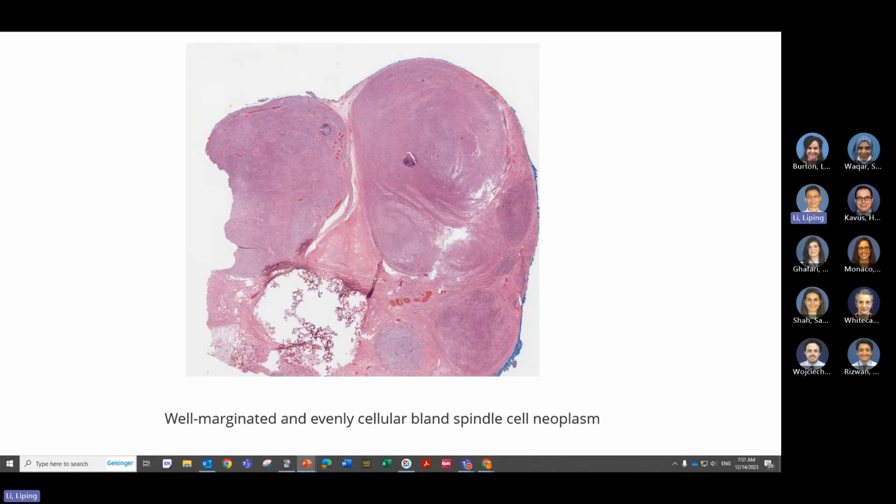from all the entities we already talked about today. They're forming this nodular, multilobular pattern, and then separated by this fibrous hyalinized septa. And even in low power, we know there's not a lot of stroma here.